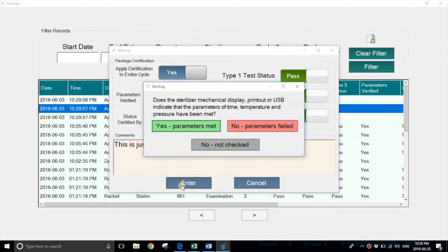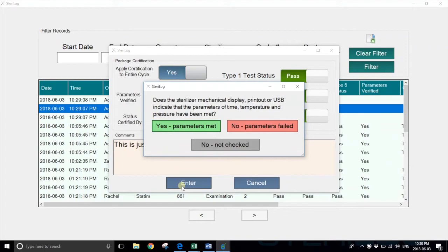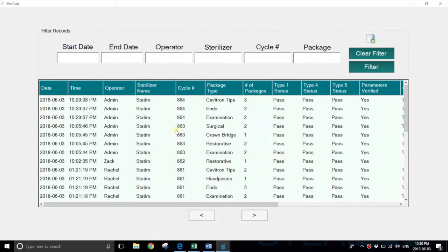Now she's prompted to verify that the parameters of time, temperature, and pressure from the sterilizer have actually been met. This means she's checked the mechanical display, the printout, or the USB directly from the sterilizer. If she's done so, she can hit yes, and she's then certified the entire cycle.